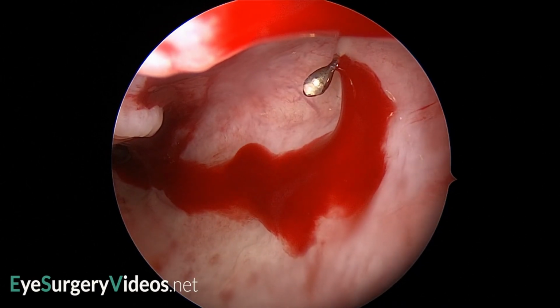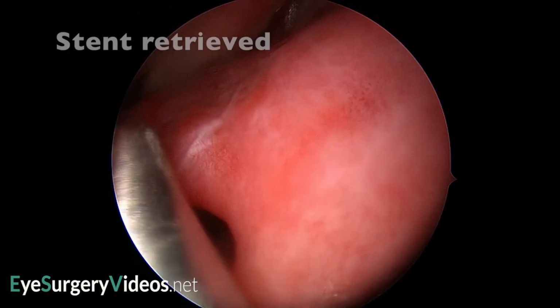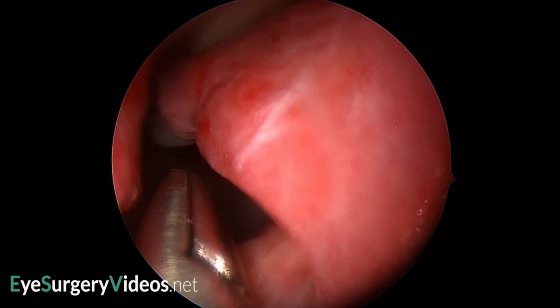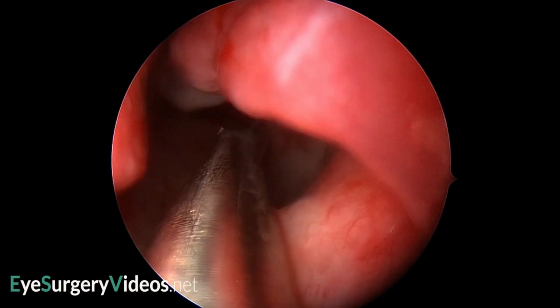Syringing the nasolacrimal system with a viscoelastic substance can aid stent insertion and reduce the risk of catching on the sac or duct walls, which might then form a false passage.